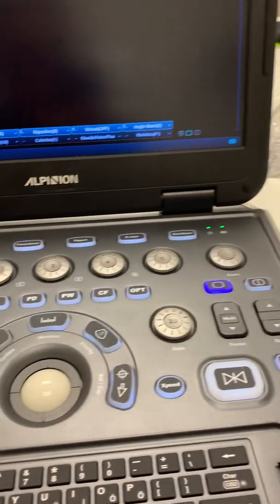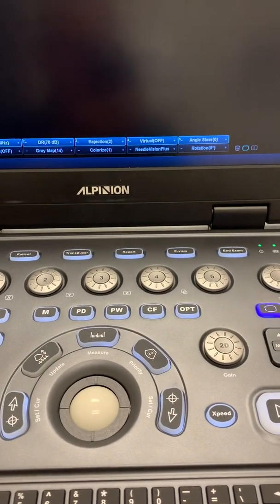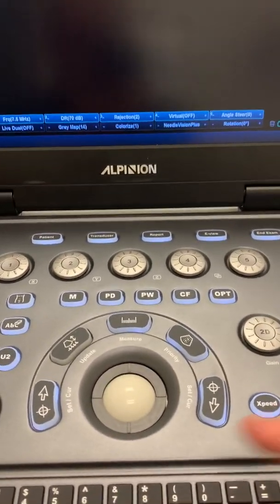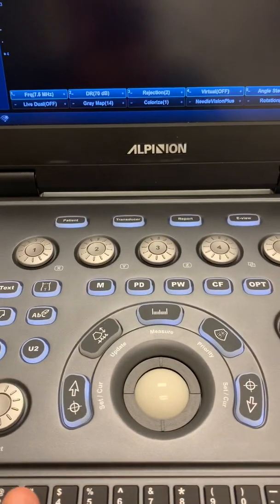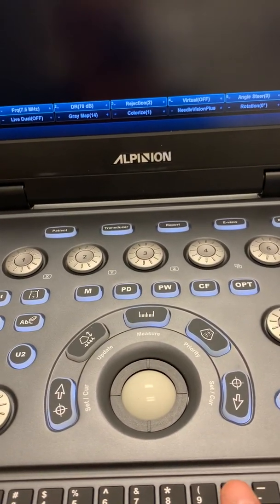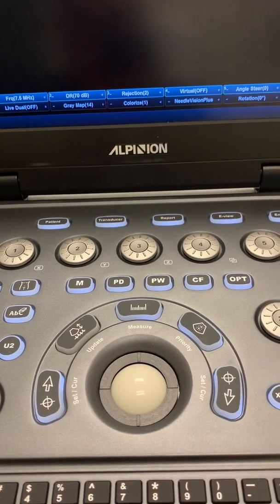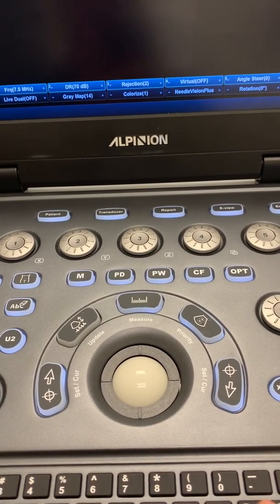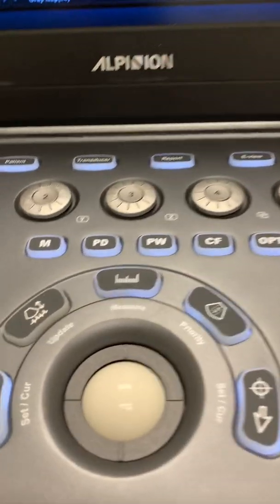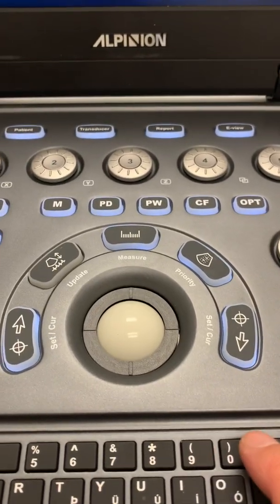In the user interface what we usually do is program one of the keys here from one to zero to do the harmonic imaging. In this case, in this machine I have programmed the key number zero to do harmonic.